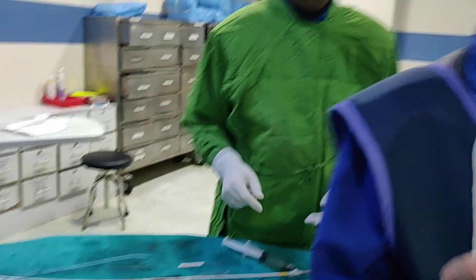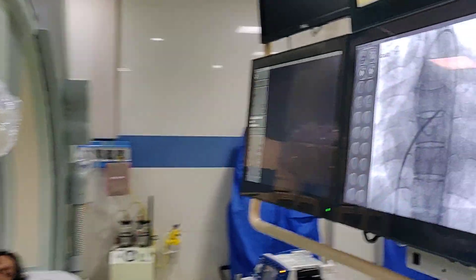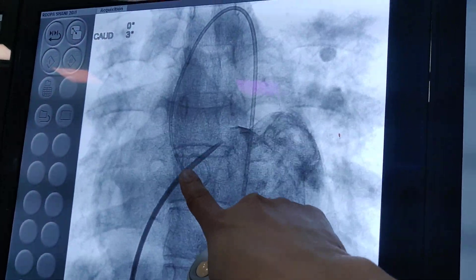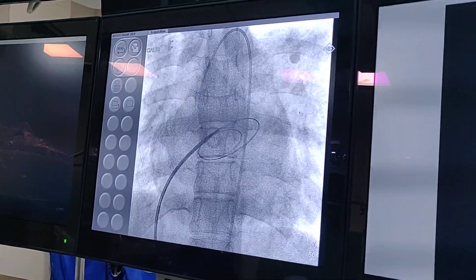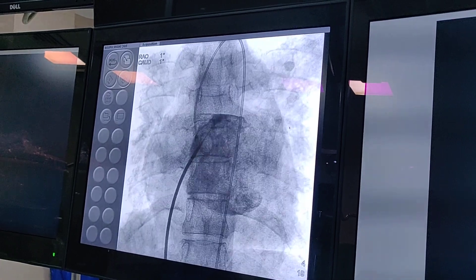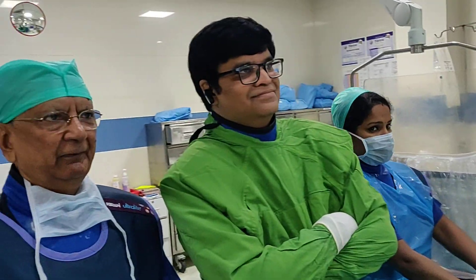There was a little problem when we started. The first time when we punctured the septum, it was possibly a little higher puncture. We punctured the septum and measured the pressure in the left atrium, but when we tried to negotiate the balloon into the left ventricle, it was not going. So we thought that possibly the puncture was too high. We took another puncture at a little lower level and then proceeded with the procedure.